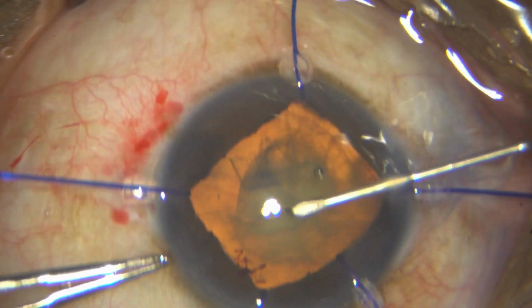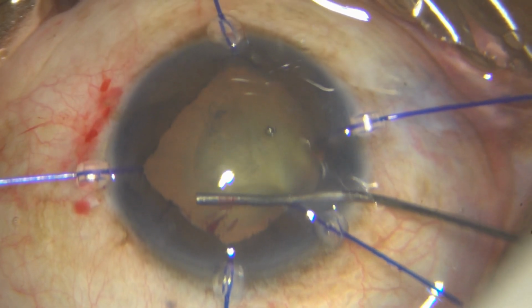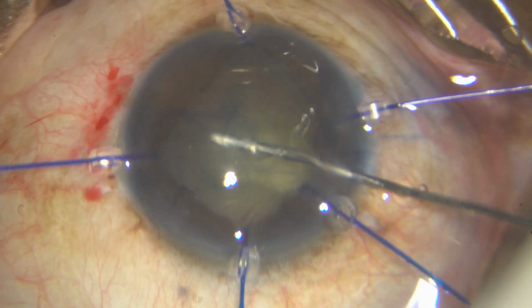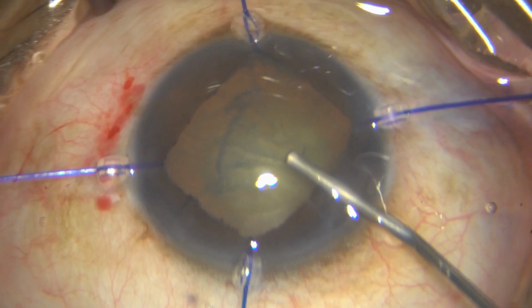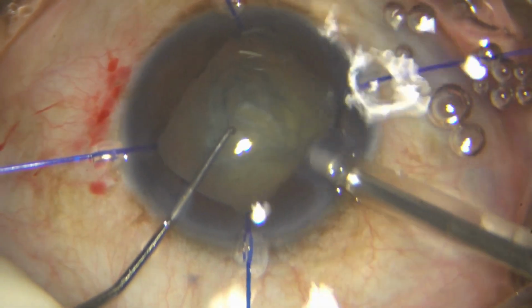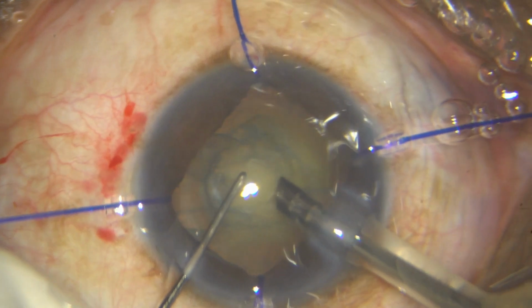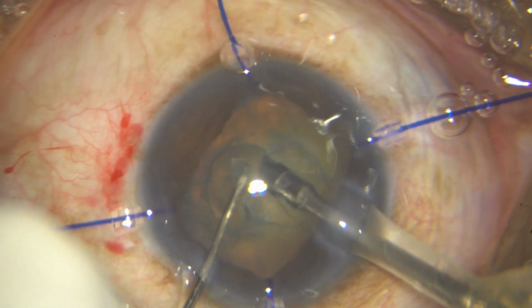Once that's been done, I go ahead with my hydrodissection. There was one complete fluid wave there. I decompress. Just pressurize the chamber a bit, put in some HPMC. I've taken out the iris hook from the main incision, and now it's time to phaco. And this was not such an easy cataract to phaco. I think the main problem was it's a bit on the leathery side, and the hard part of the nucleus is hardly confined to a few millimeters. So the moment I cross those millimeters, I am into the soft epinucleus, and there is not much of a hold there.